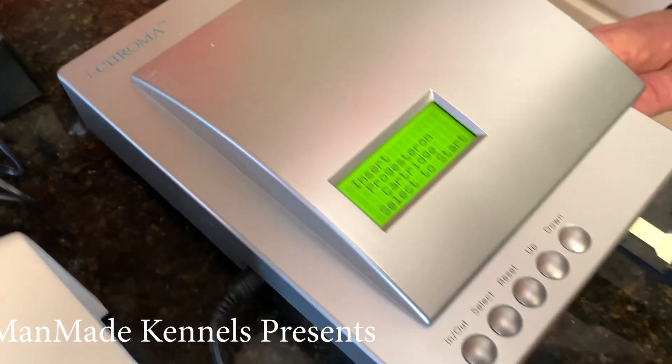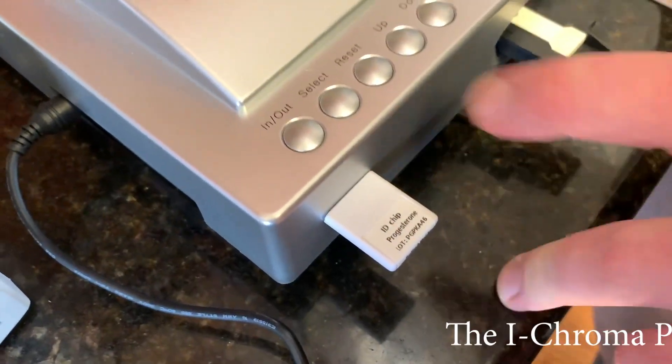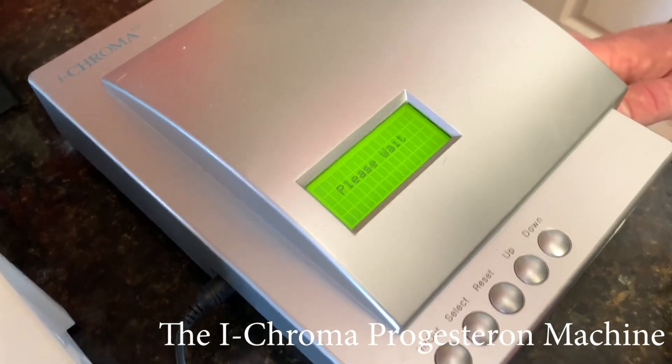This is called an i-Chroma progesterone machine. Everything's already pre-set. We've got our ID chip in, so now we just select. Is it going to tell us our numbers? Is that what it's doing?